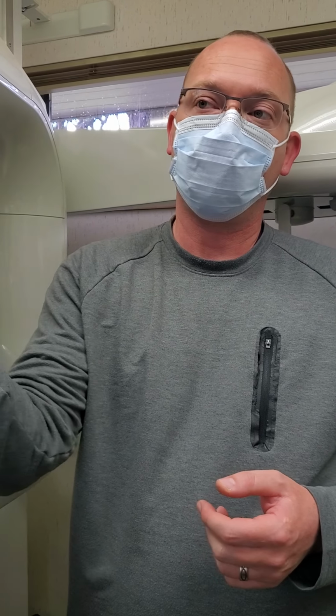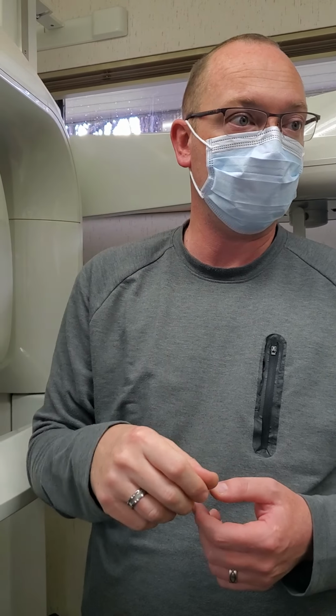Okay? So then you would exit the room, close the door so that we're not sending scatter radiation out into the clinic, and you push and hold the exposure button for the entire time that it's moving. You cannot let it go at any point during the scan.